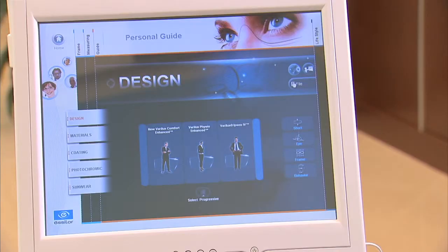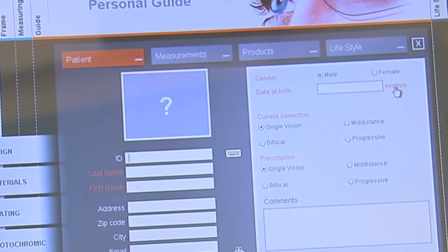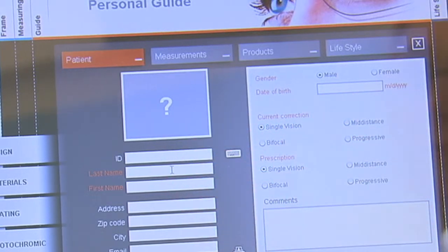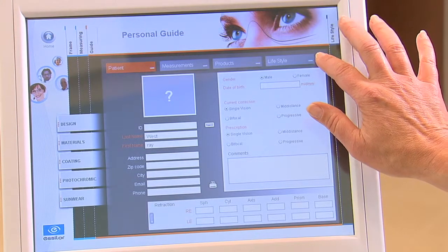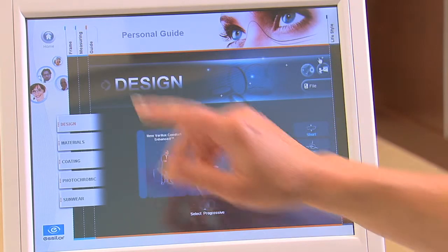The VisiOffice software always starts in the guide section. Before reviewing the educational tools in this section, press the file button to start a new patient file. Type in the patient's first and last name using the keyboard. You can add any additional information, like prescription or patient's address that you wish. Save the file by clicking on the X at the top right of the screen.